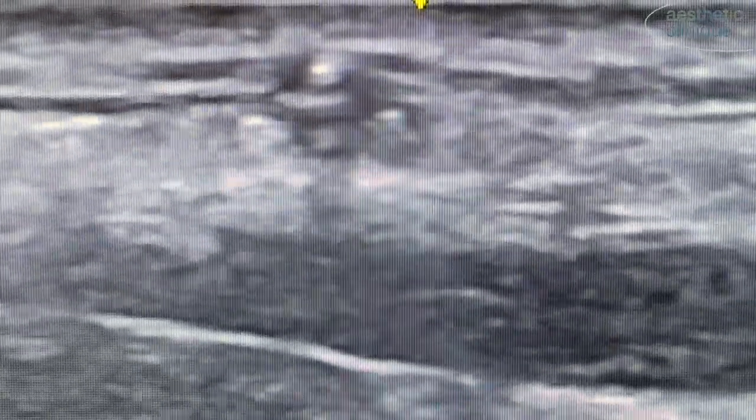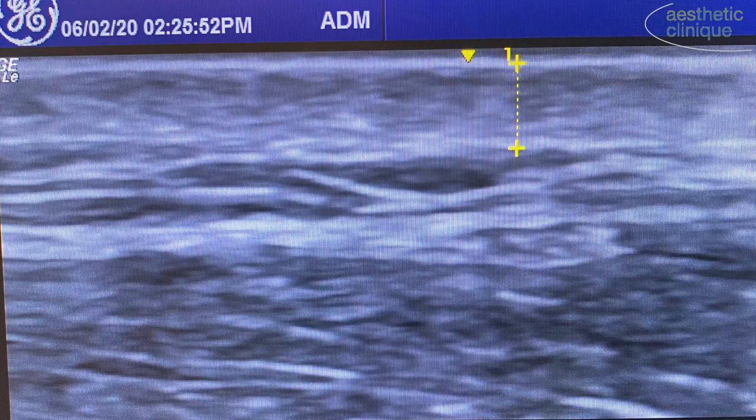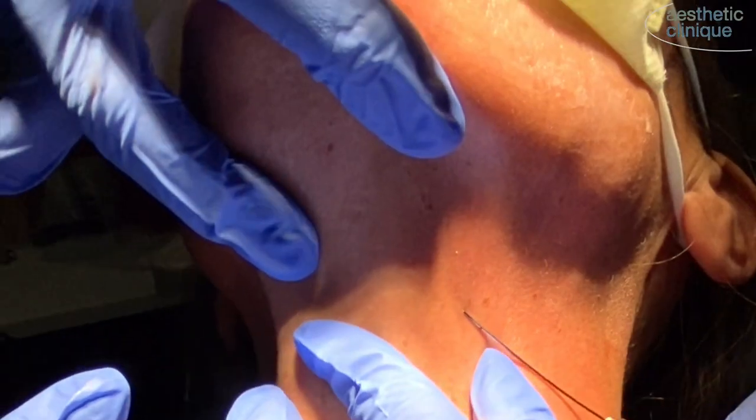This is a different view of the same type of injection with the probe being perpendicular to the cannula, or what they call the out-of-plane injection technique. The first image is an ultrasound view of the neck without injection, and you see in the deep aspect the platysma. And this is after the Radiesse — you can see the clouding in the subdermal area, and that is the Radiesse.